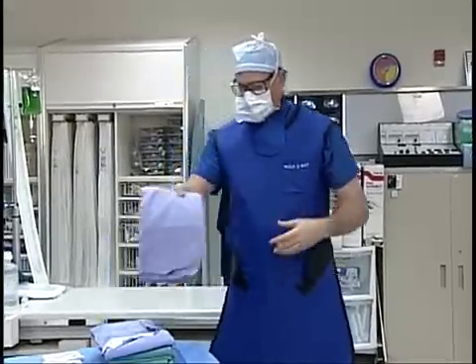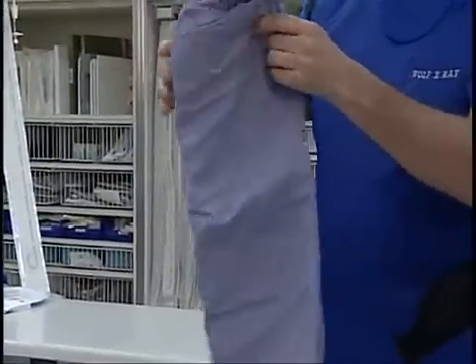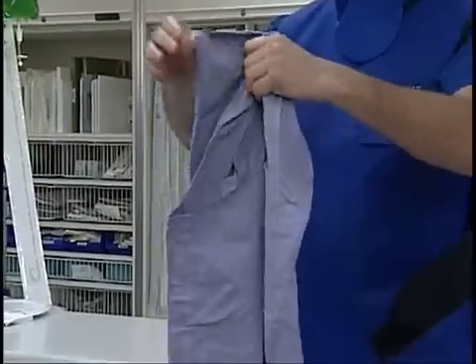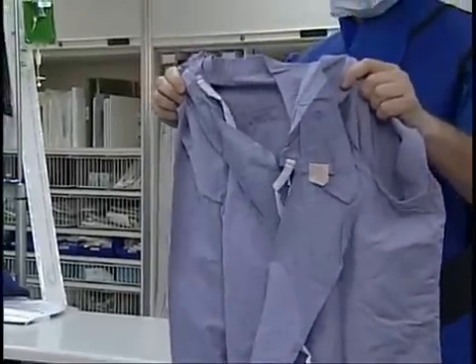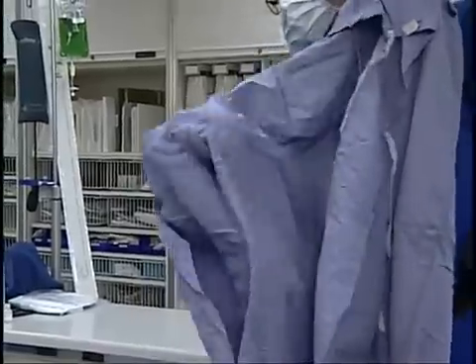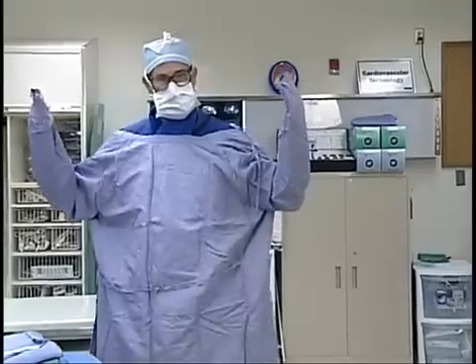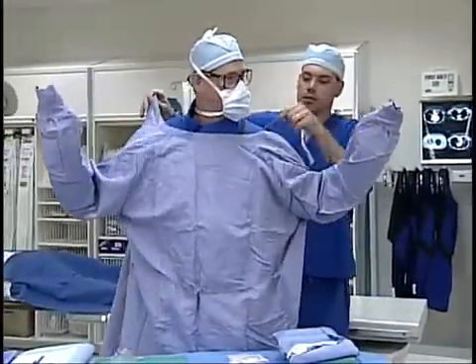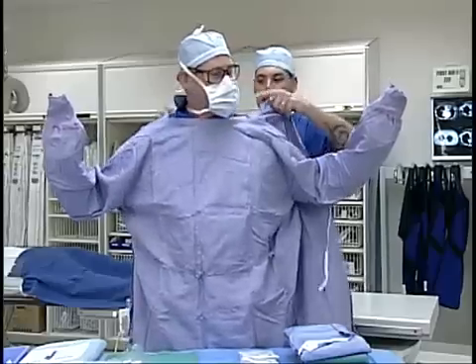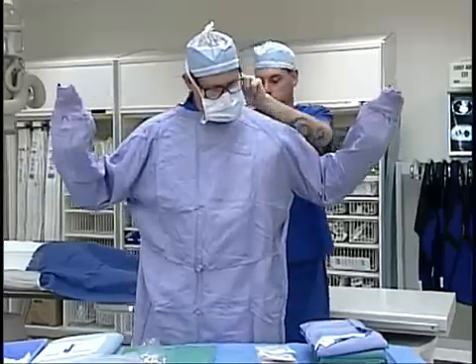Now he'll take a gown off the field. The gown is folded in such a way that it is inside out so that the parts that will touch his body — and will not be sterile anyway — are the parts he is grabbing. He proceeds to put his hands inside the sleeves, taking care not to extend his fingers beyond the cuffs of the gown. Scott's not going to be able to tie his own gown because his backside is not sterile, so he's going to need a non-sterile member of the cath lab to tie it — this is usually done by the circulator.